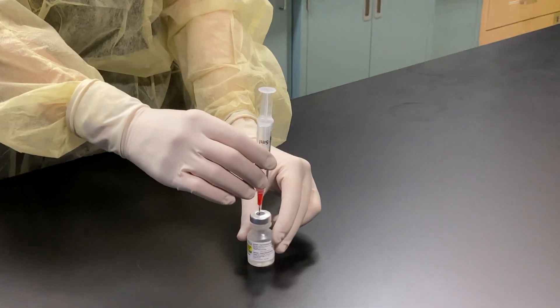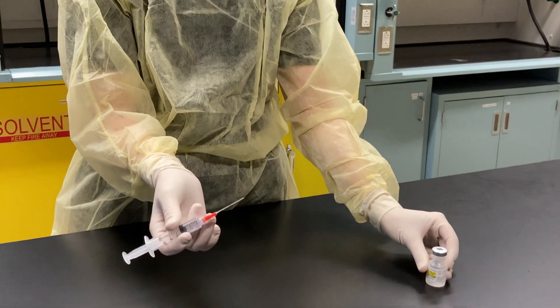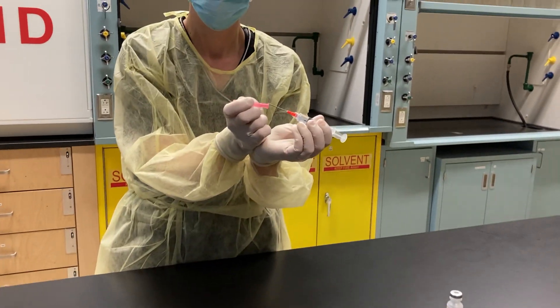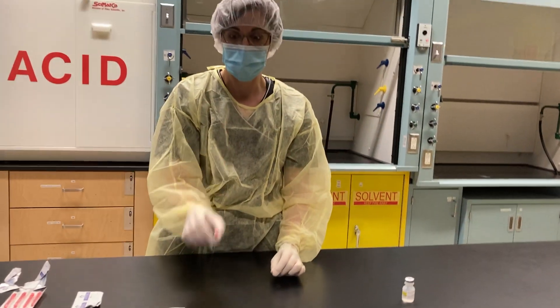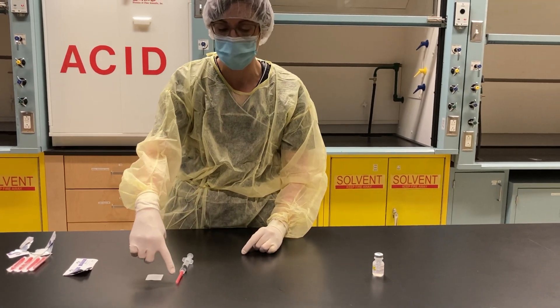Then I'm going to place my vial back on its surface, remove my needle, and cap it. Now I can lay my syringe on the work surface as all the critical sites are covered.